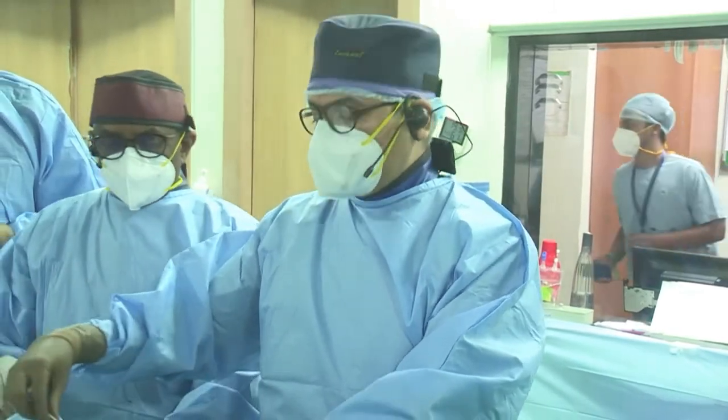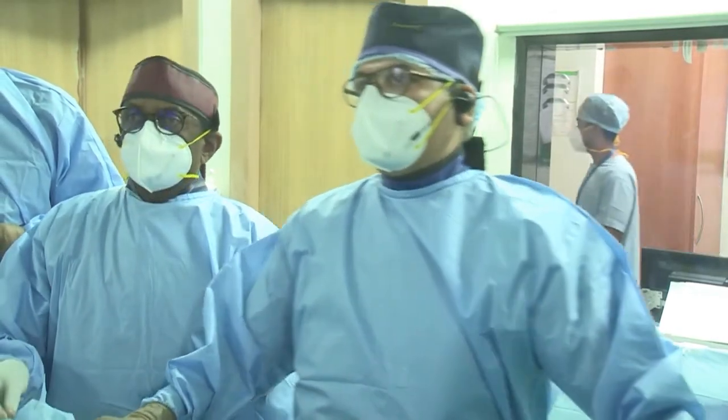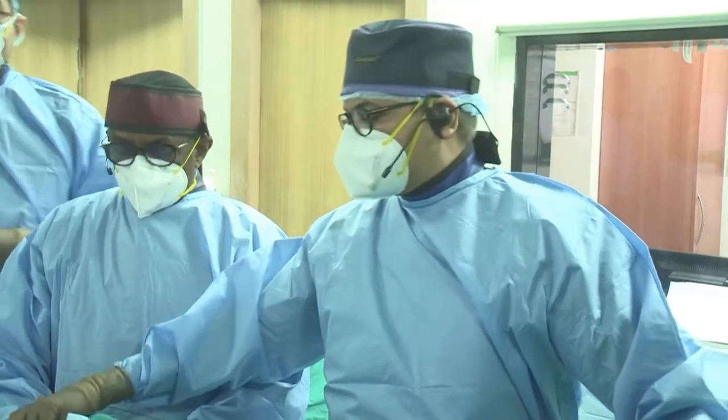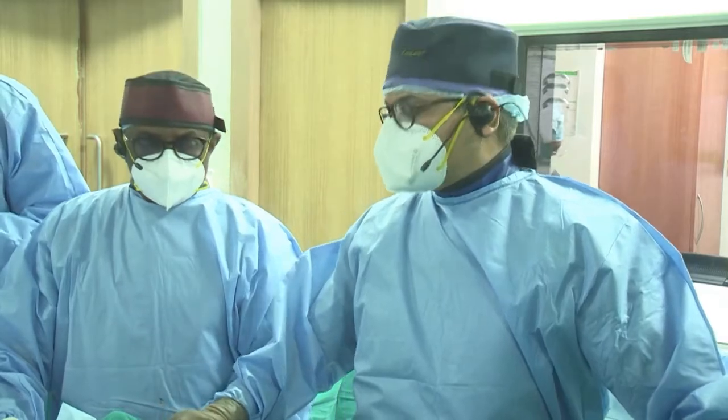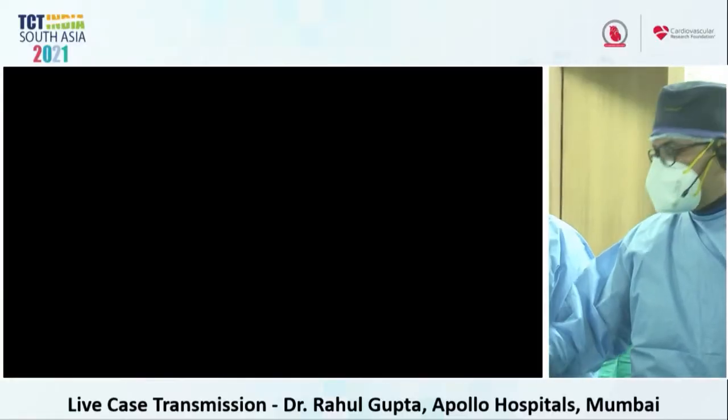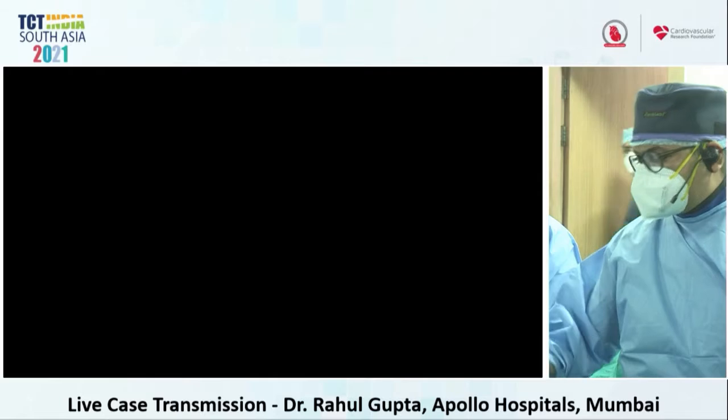We are just going above, so I am with the dilator as well as the guiding. I am going both. Dr. Pillai, you can show the fluoro screen now. Now, can you show the fluoro, please? Sir, so take the wire a little bit back.